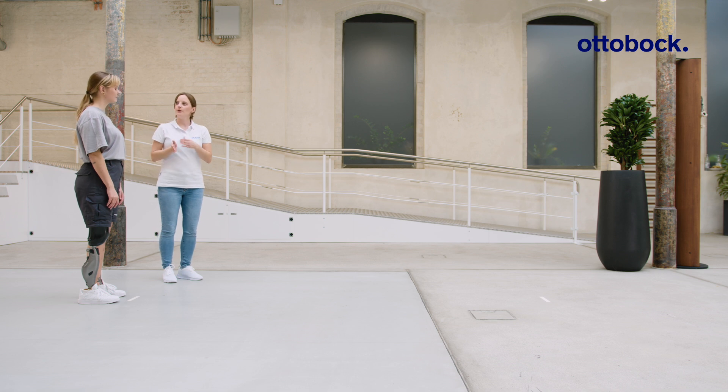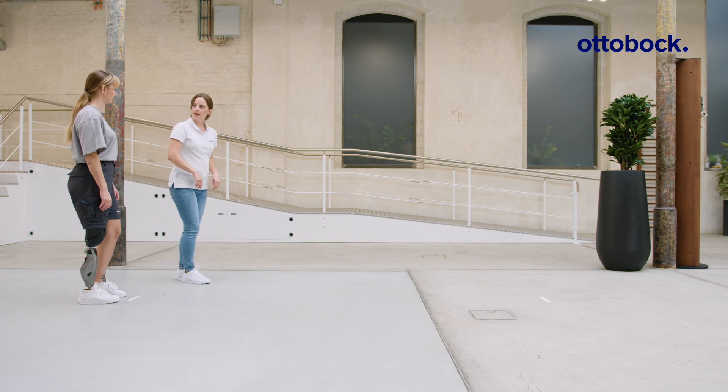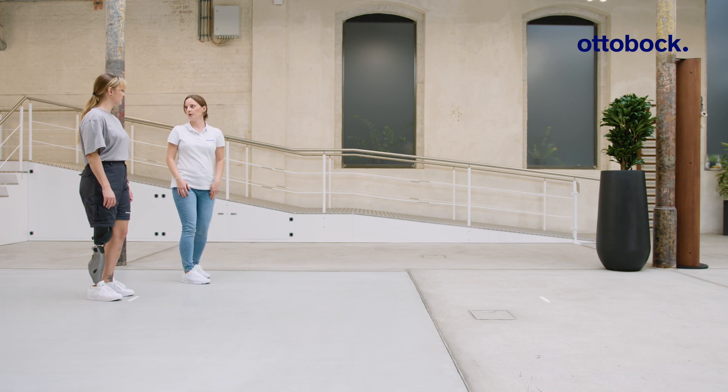Walking with small steps requires balance and technique. In this exercise, we train the user to take as many steps as possible within a given distance, while minimizing effort.